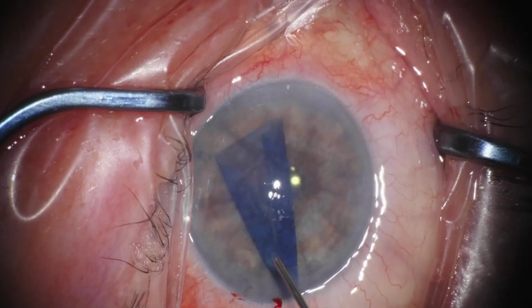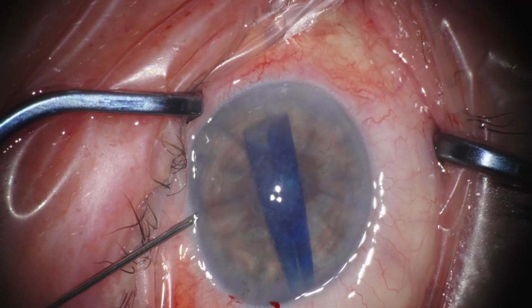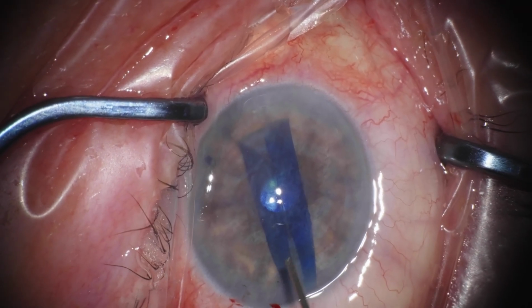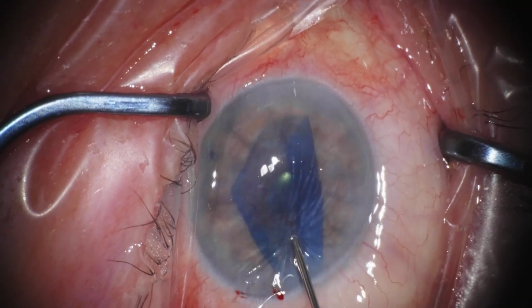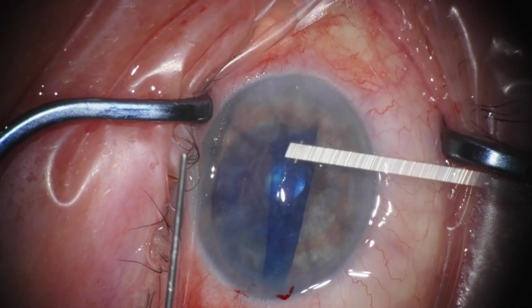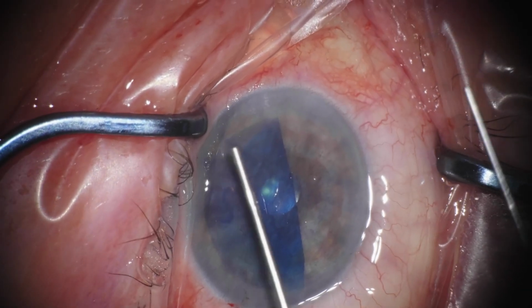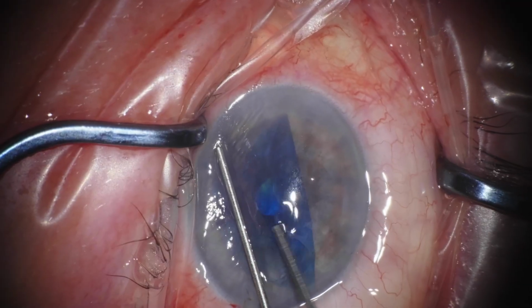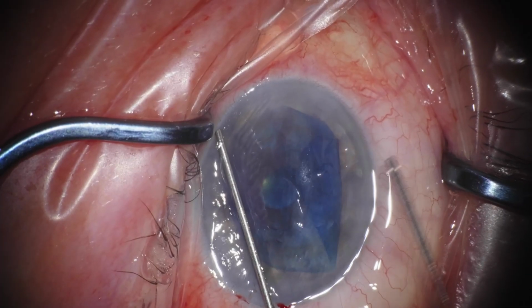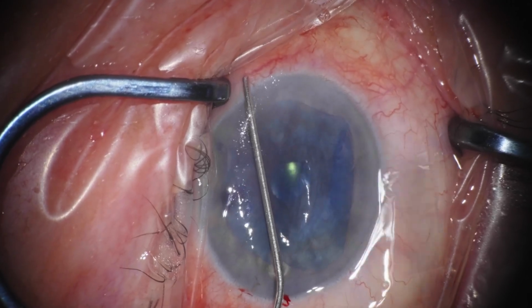But this is not the end of the case, because even if the graft is properly oriented, it's still difficult to position it and unfold it if the chamber shallows, especially if it shallows unevenly. For example, in this moment of the surgery, you can appreciate that the graft is a bit pinned towards the 6 o'clock position on the screen, and it doesn't really want to move with normal tapping. And even the Dirisamer taps don't really work that well, and they always end up shuffling the graft around.